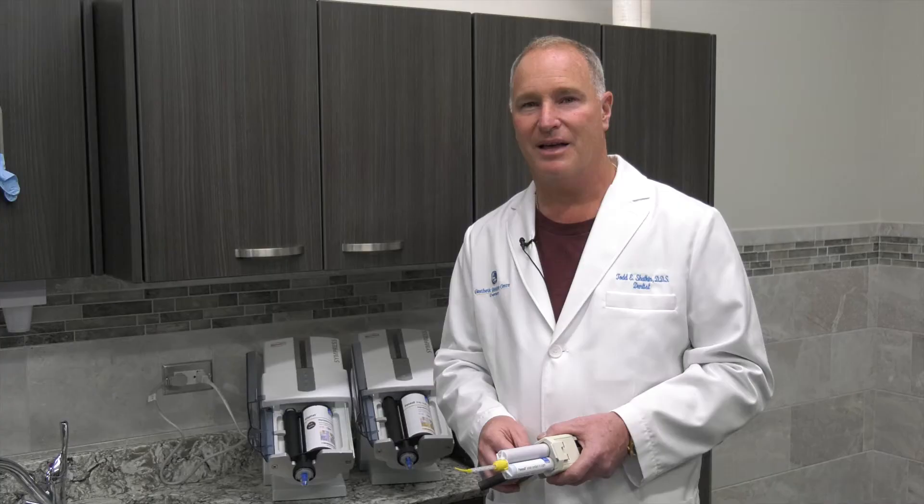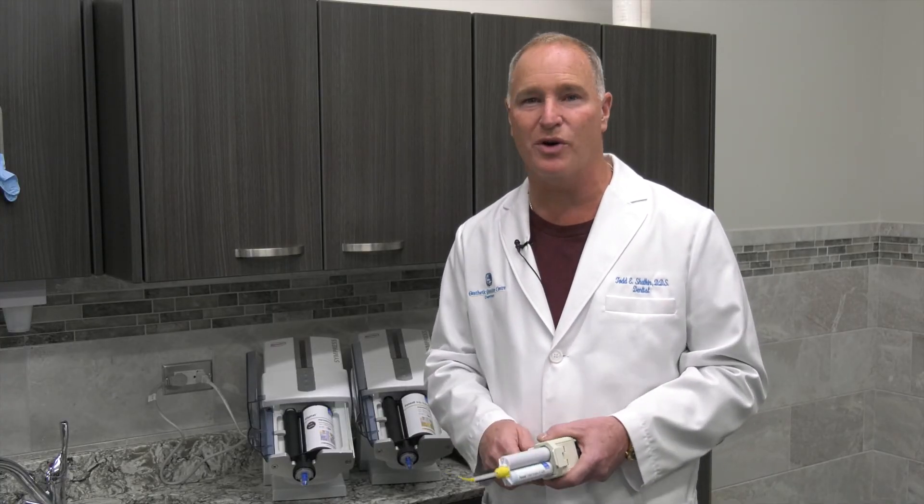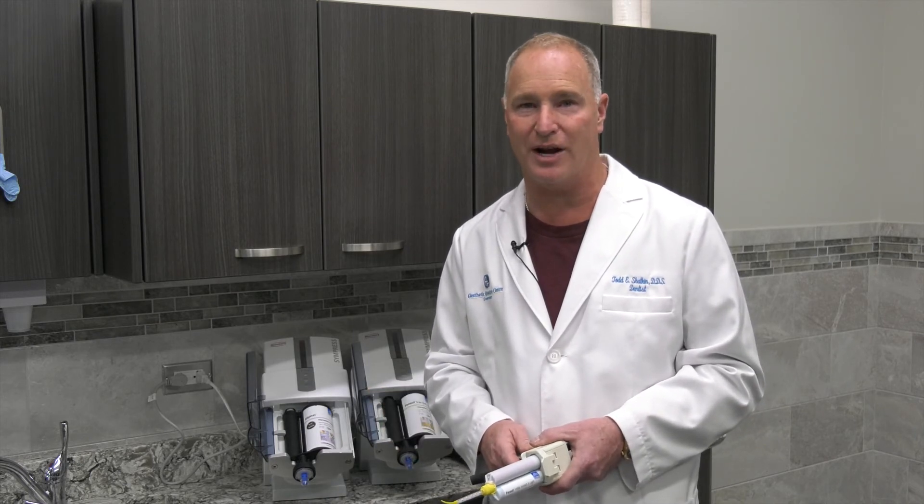So whatever you might need, just give us a call and we'll help you out with these impression materials. What you're going to find is better fitting restorations and better results for your patients. Thank you for joining me on this Monday Morning Minute and I look forward to seeing you all at one of our upcoming courses here in Buffalo at our new training center.